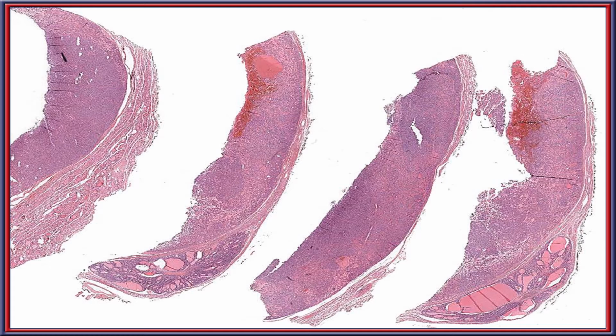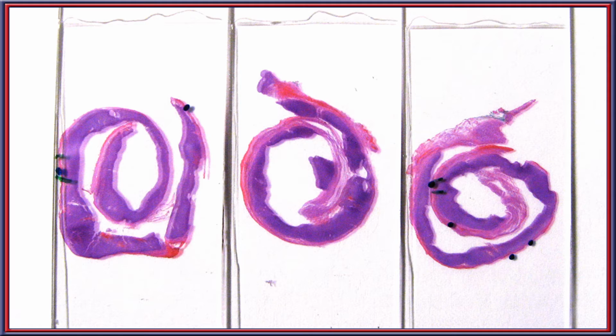If you look at the features, you can see that there are 4 different sections of this tumor put into a single cassette. And you will notice there is a very well-formed fibrous connective tissue capsule around this. There's a small adenomatoid nodule or background of hyperplasia over here, but you can still see that there is a well-formed fibrous connective tissue capsule with 4 pieces of the parenchyma to capsule to tumoral interface, which is what you're trying to identify. Some people use a jelly roll. This is very similar to what one does with the membranes of a placenta. Here you can see this is the capsule, here is the tumor inside, and of course this has been rolled in order to be able to get as much of that periphery view.